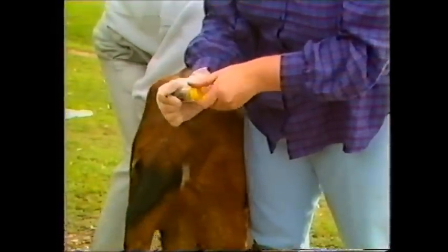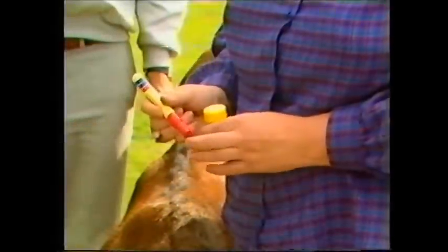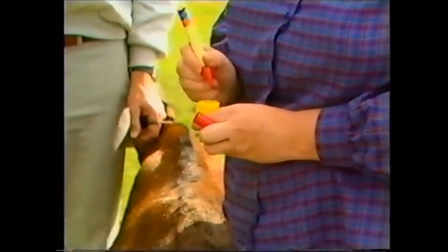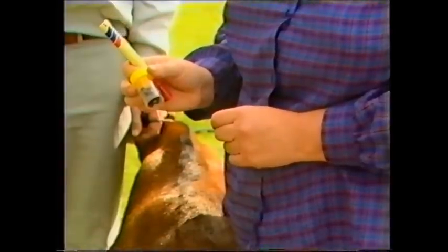Fecal droppings which are picked up off the ground are not suitable for worm egg counts. It is important that the sample is labelled with a number that corresponds with the goat. These samples are then kept chilled until they can be taken to the nearest laboratory or laboratory picker.